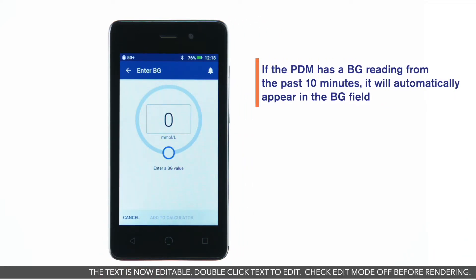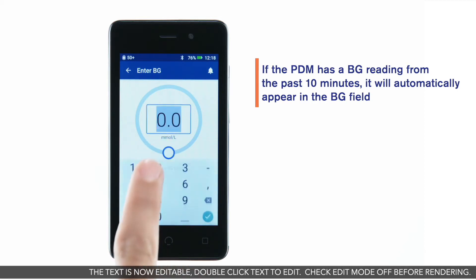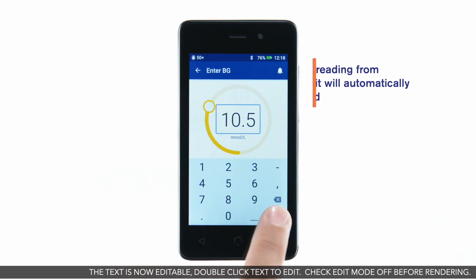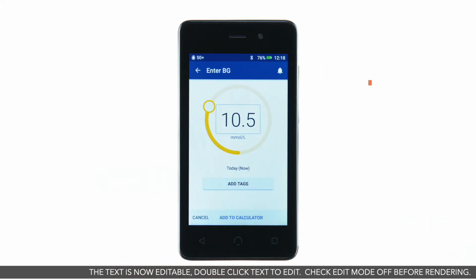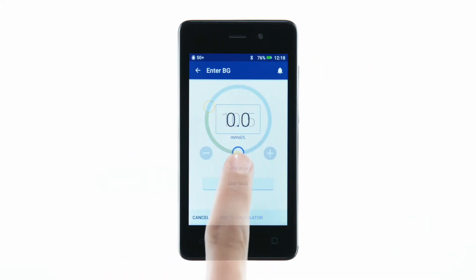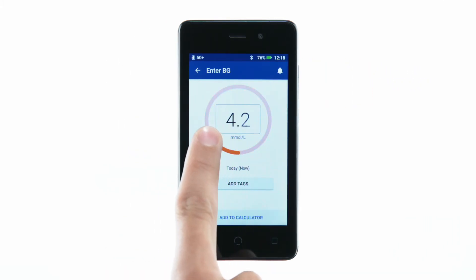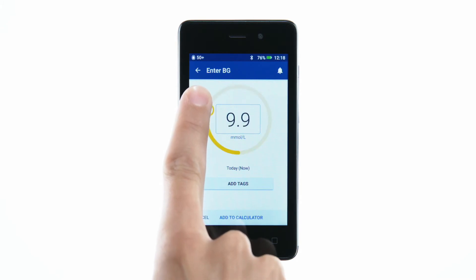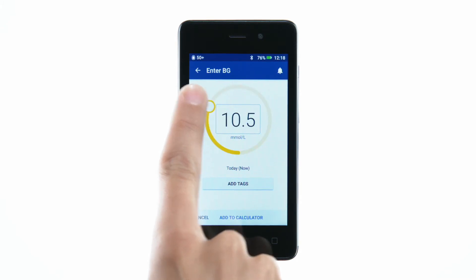To manually enter a blood glucose reading, tap the box inside the circle and enter the BG reading. You can also use the slide wheel along the circle to enter a BG reading.